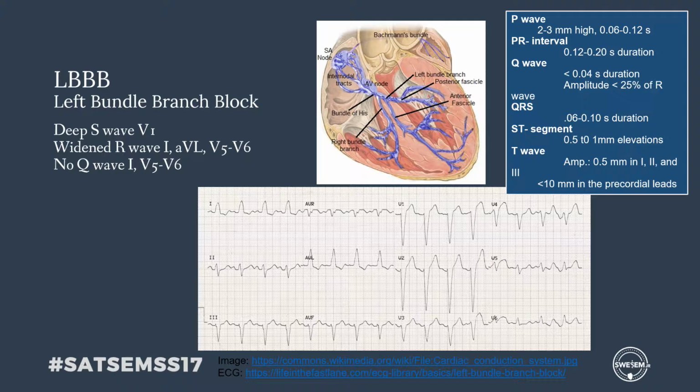So essentially, it's a bump in the road that alters the planned path of travel for electricity and thereby systolic activity. This bump in the road will cause a widening of the QRS complex because the efficient method of ventricular depolarization is interrupted.